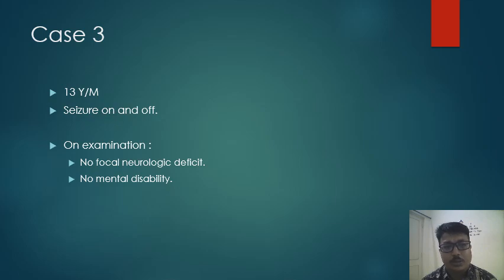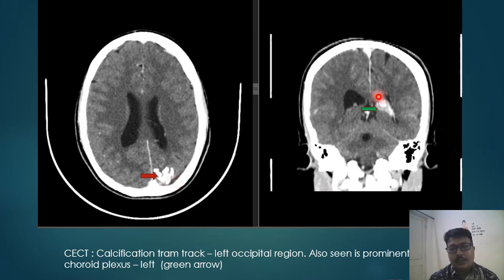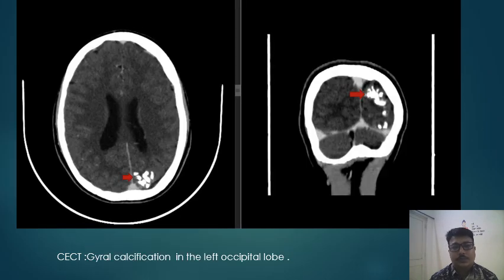Case 3 is a 13-year-old male who presented with seizures on and off. On examination, there was no focal neurological deficit and he does not have mental disability or mental retardation. CT scan axial and coronal sections show gyral calcification in the occipital lobe, indicated by the red arrow, and prominence of the ipsilateral choroid plexus identified by the green arrow. The same patient also shows gyral calcification visible in the axial and coronal sections of CT.